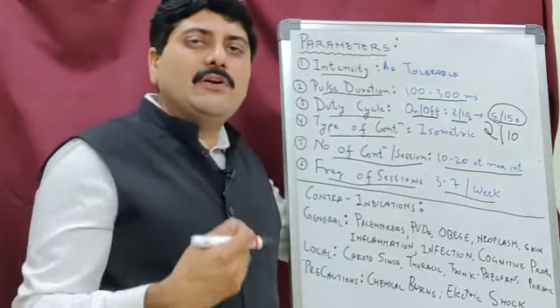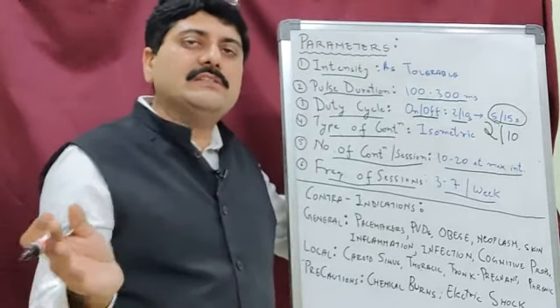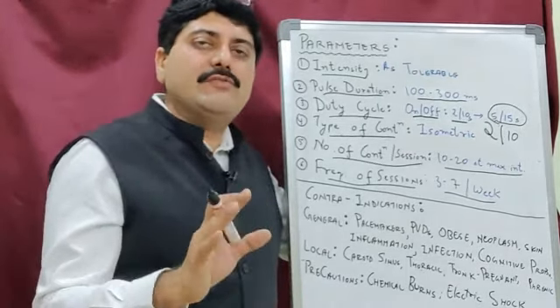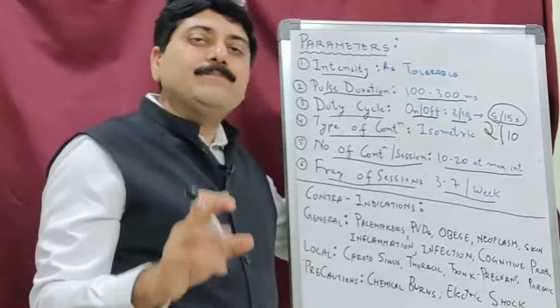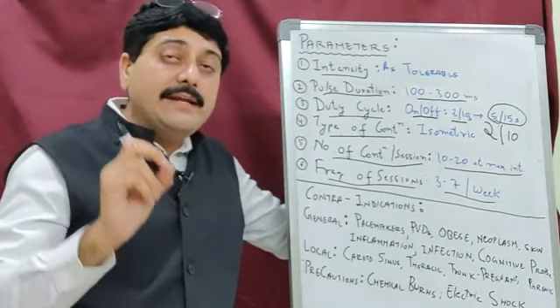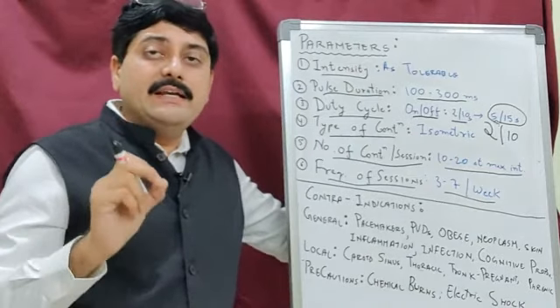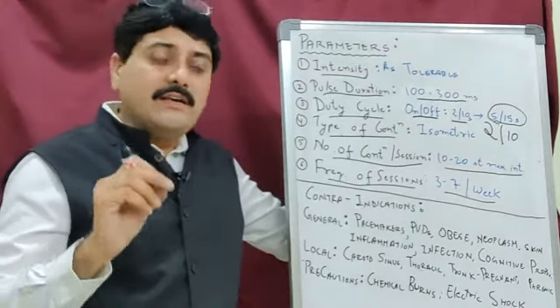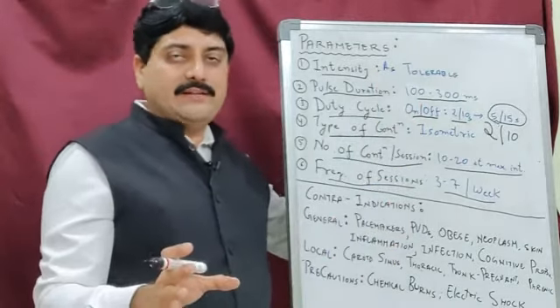It has a little bit of variation in this frequency, but it doesn't make a lot of difference. So the minimum bare essential frequency is 3 times per week, 2 to 3 sessions of 10 to 20 contractions with maximum tolerable current in each session. So this is very important. These are the parameters for how you are going to treat the patient.